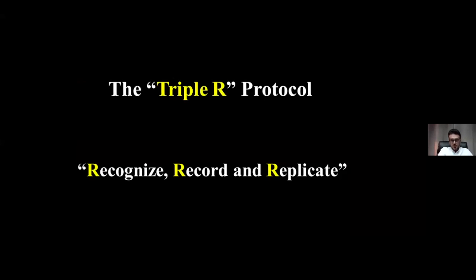So back to our protocol, we call it the triple R protocol, and the triple R comes from 3 R's. The first is to recognize, the second is to record, and the third is to replicate. So these are the 3 steps that we are going to memorize and use as a workflow to produce or to mimic the natural teeth.